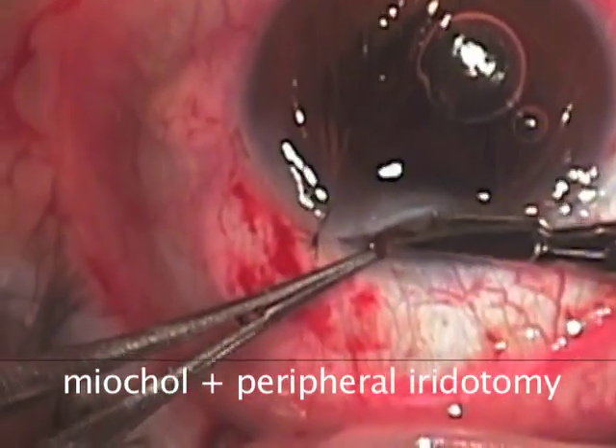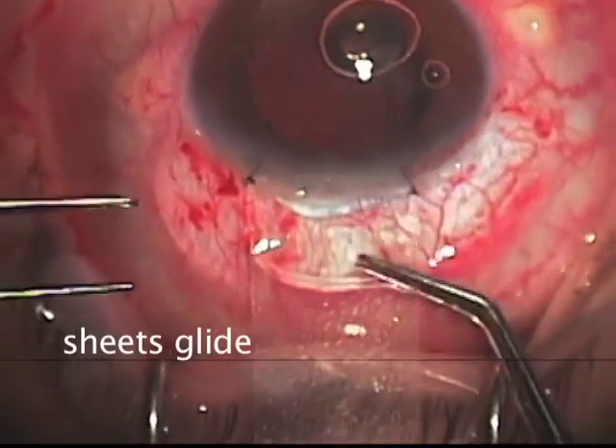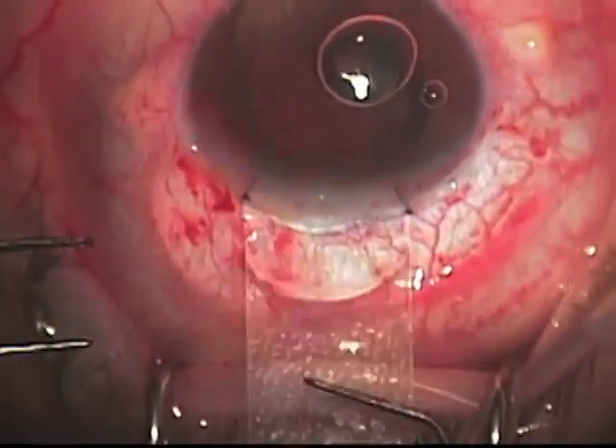we can place miochol in the eye and perform a peripheral iridotomy before placing the sheets glide which will direct the lens implant into the anterior chamber.